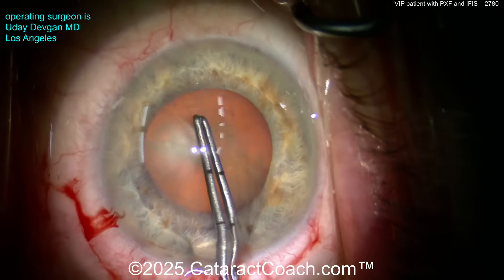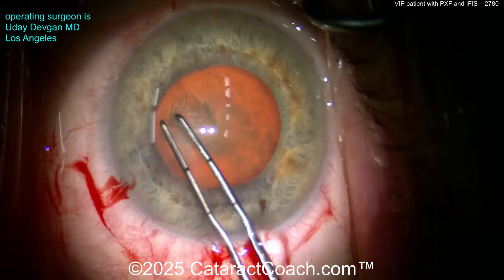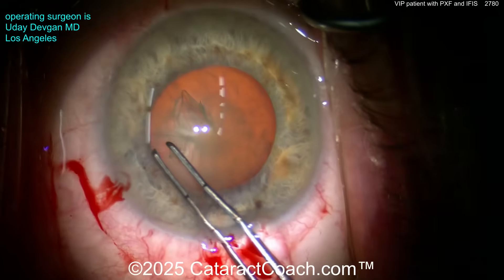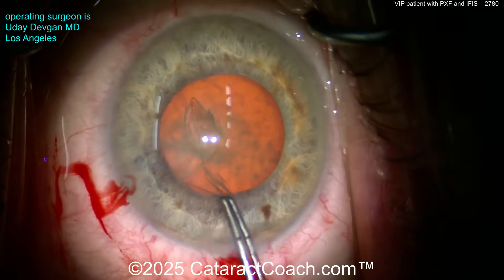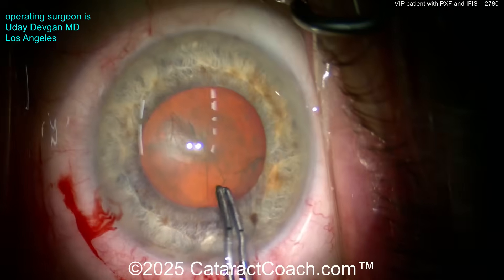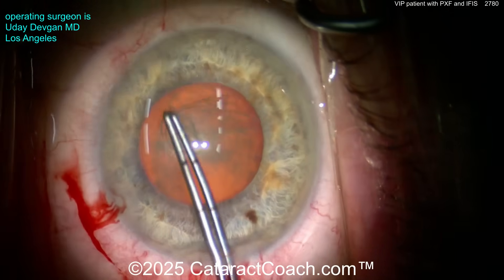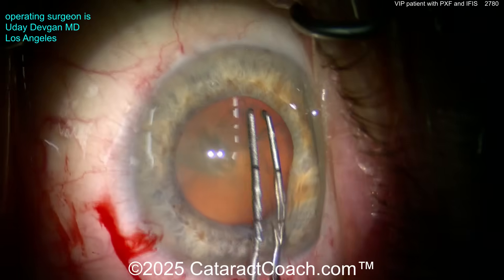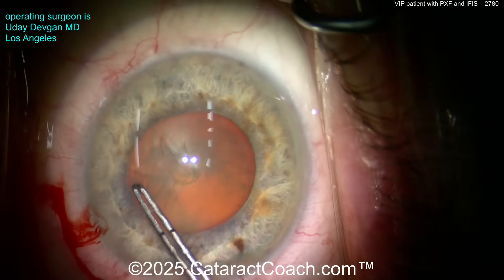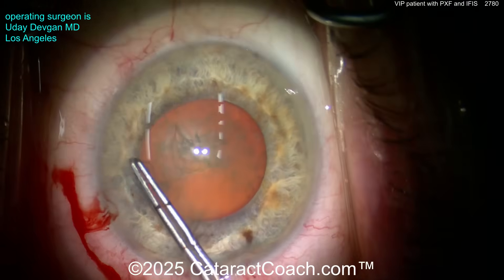Poking into the capsule here — a little bit of capsular laxity there. You saw a little bit of wrinkling, but not terrible, so that's a good sign. Now we're getting the rhexis done, and I'm going to make the rhexis about as big or even slightly bigger than the pupil. Notice how you don't see the rhexis edge as we're doing this because I'm making it right at the pupil margin or even slightly larger. Even though this patient doesn't dilate well, I still want that 5 to 5.5 millimeter rhexis, and that's why I have those measured, marked-off forceps — so I know exactly how big to make the rhexis.